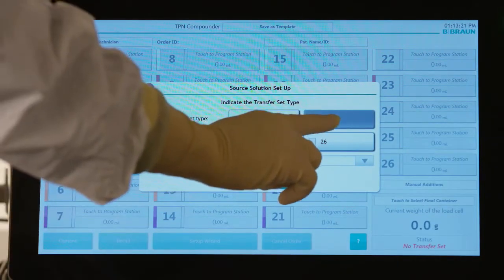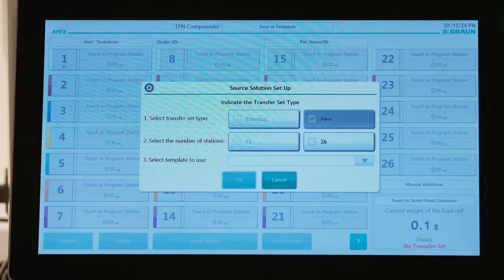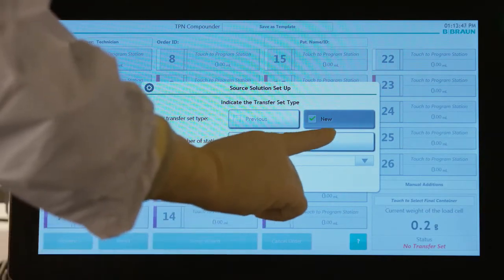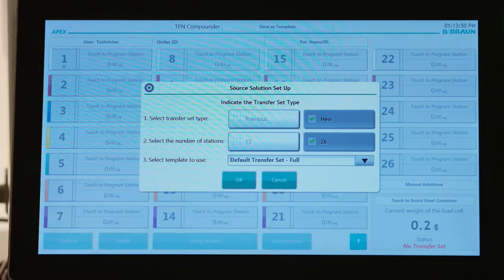Tap New when you're starting APEX for the first time of the day. Tap 26 to select the number of lines in the transfer set you will be using to compound orders.